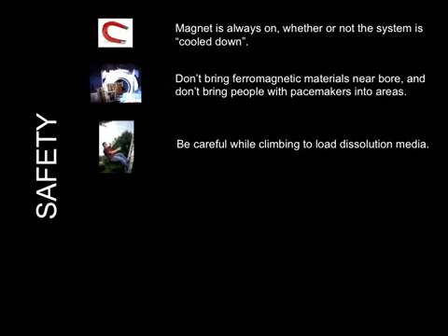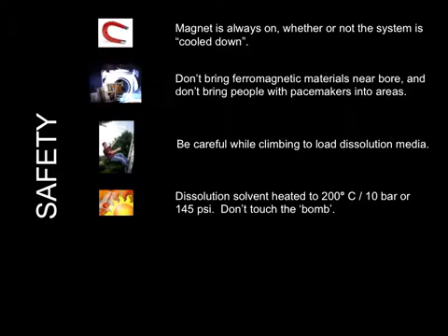Another safety issue, which I've seen can be problematic, is you want to be careful when you're up on ladders, loading up dissolution media into the HyperSense in particular. You've got to climb up and reach the bomb part at the top, which we'll talk about the anatomy of in a minute. Another thing to be aware of is heat. The big bomb up there is going to get up to a very high temperature, 200 degrees C, and high pressure. You don't want to really mess with that too much. You don't want to touch any of the metal stuff up there at the top of the HyperSense.